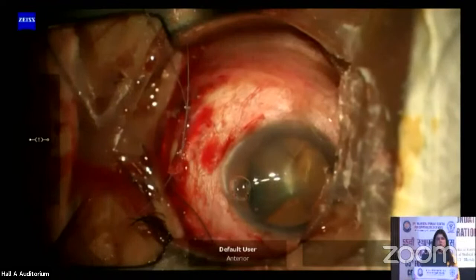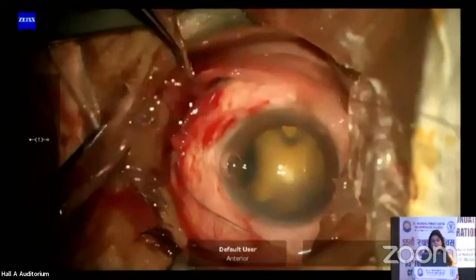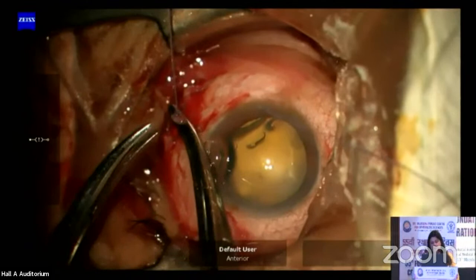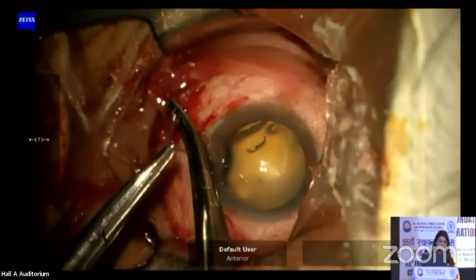So this is an important thing here. I would just pause a little bit and tell you that, if you remember, we had disinserted the lateral rectus, and therefore now we have to use the hangback technique so that we don't lose the muscle, because at the time of plaque removal, we will be needing this. So Dr. Lomi, did you want to comment on this step?